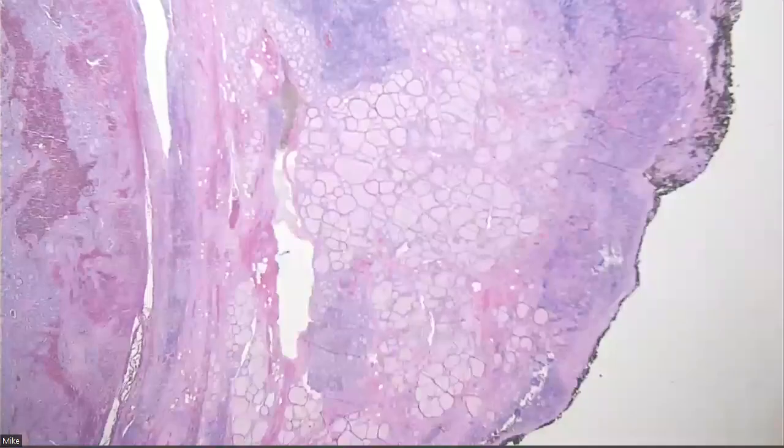Case 3. Right, we've got some chronic lymphocytic thyroiditis in the background. We have a pretty circumscribed nodule.